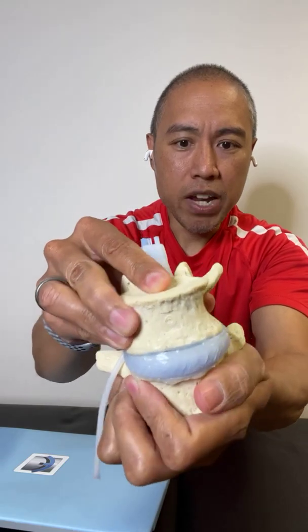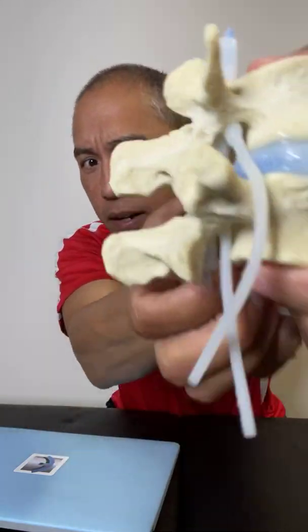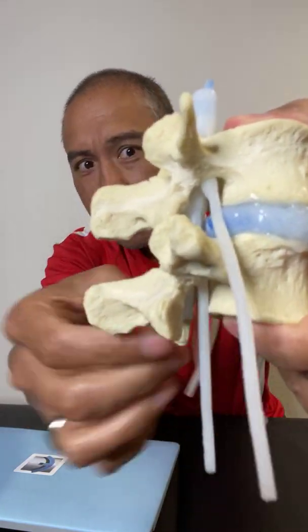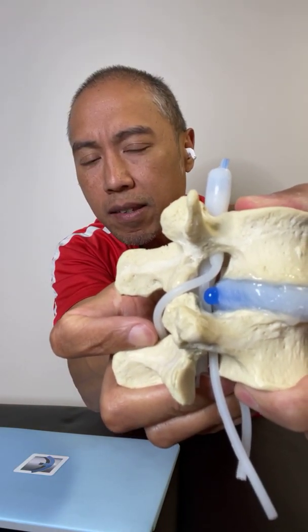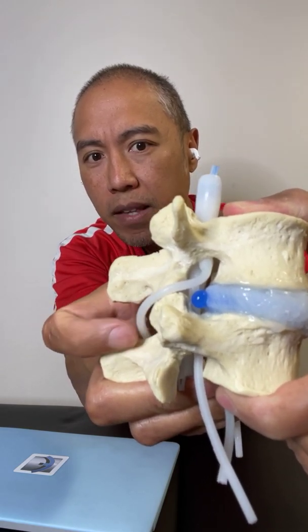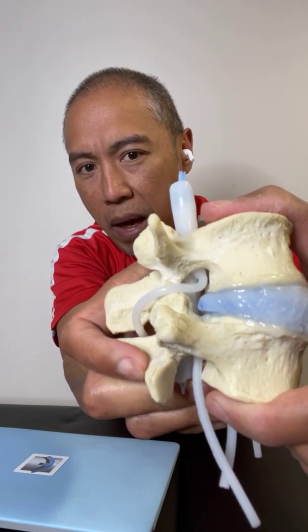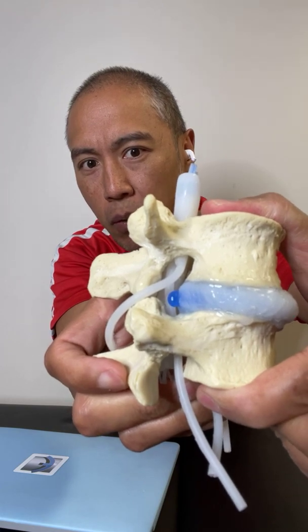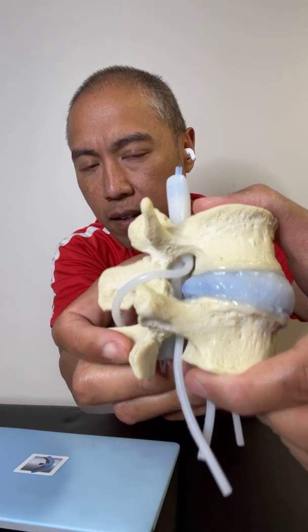This model actually flexes, extends, side bends, and has a little rotation as well. When I compress and flex it - getting that nerve root out of the way - you can see that the disc starts to extrude from the tear in the annulus. But when I extend it, it actually goes back in.